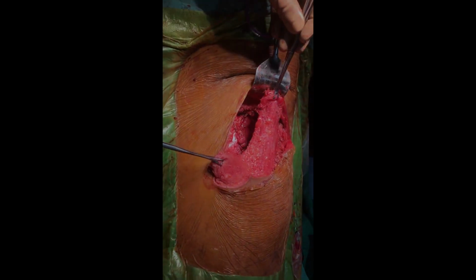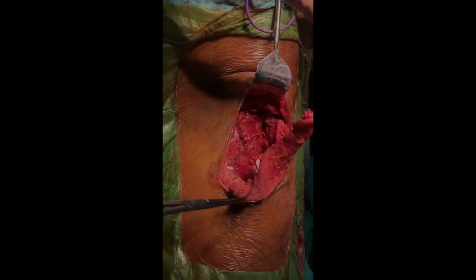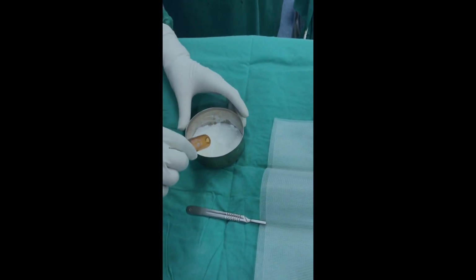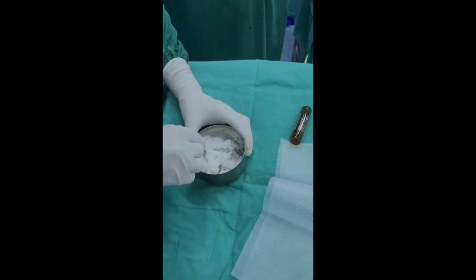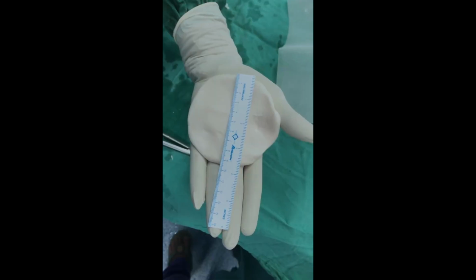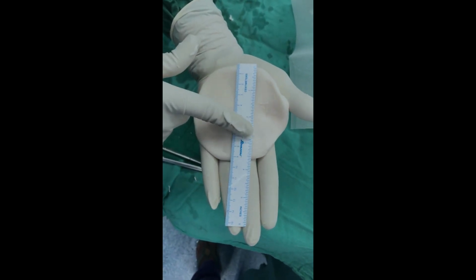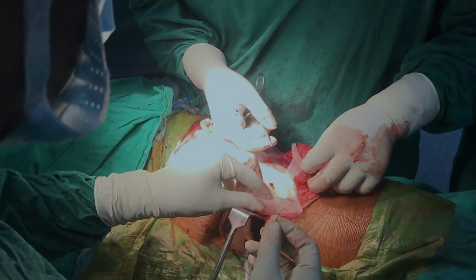The latissimus dorsi muscle flap is mobilized so that it would cover the region of the defect. We planned for a composite reconstruction with bone cement sandwiched between a Prolene mesh under a latissimus dorsi muscle flap cover. Here we prepared the bone cement. So the size of the chest wall defect was around 11 by 11 centimeters. We prepared the bone cement to a size that is 1 centimeter less than the size of the defect, that is about 10 by 10 centimeters.